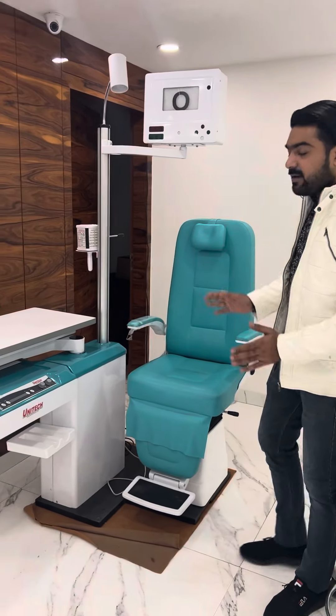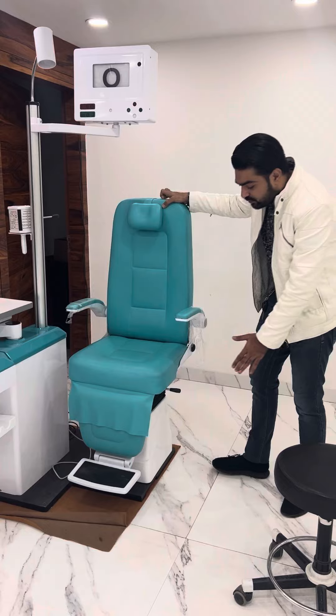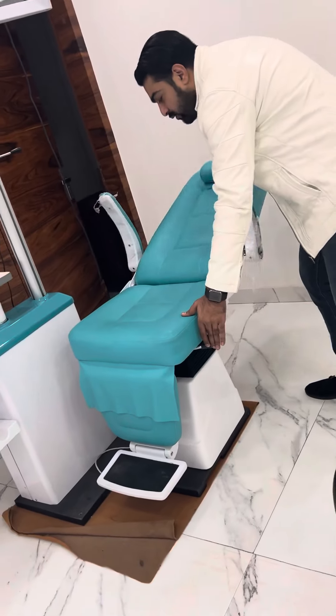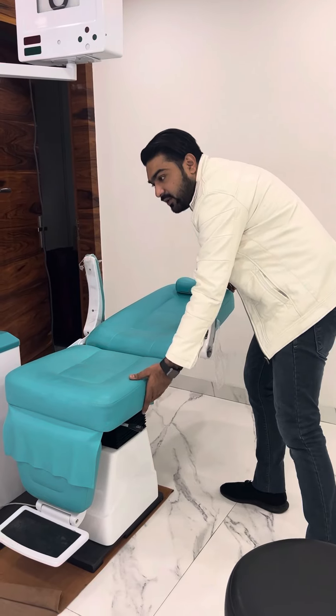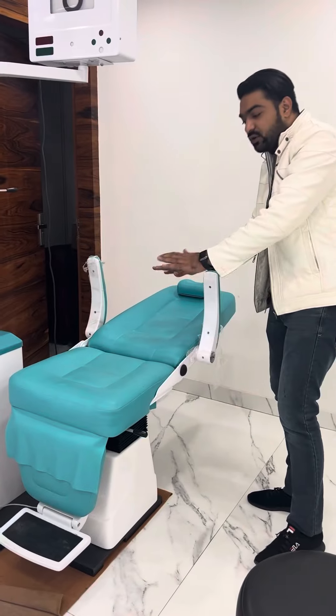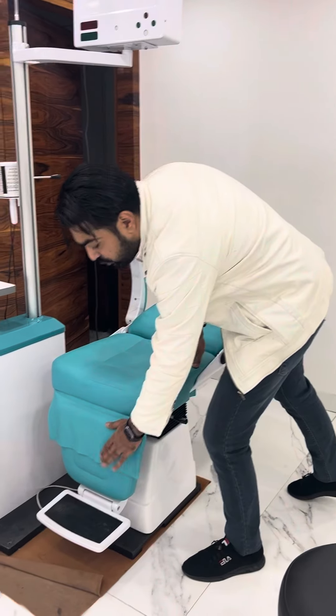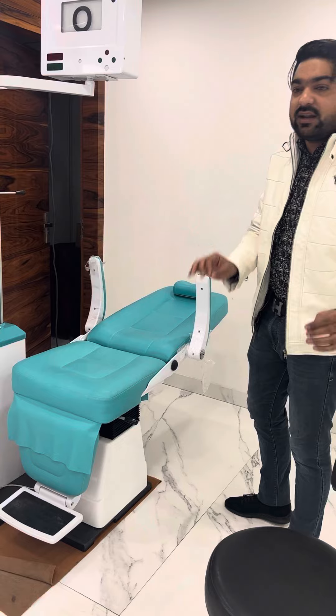Both models are the same. Only one has the extra motor. This is the back of the chair. The doctor model has the motor on the back side. The doctor model and optical model are the same.